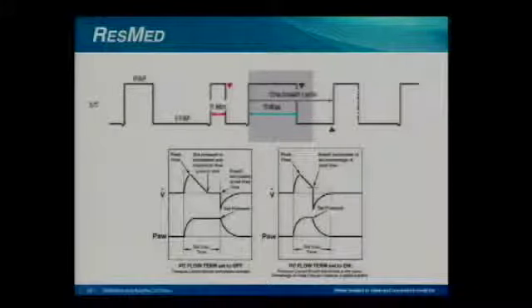The valved ventilators do not have this option, this very important option. The closest is a valve ventilator that allows the breath to either flow cycle or time cycle. But none of the valve ventilators that I'm aware of allow both the TI minimum and the TI maximum to be set.